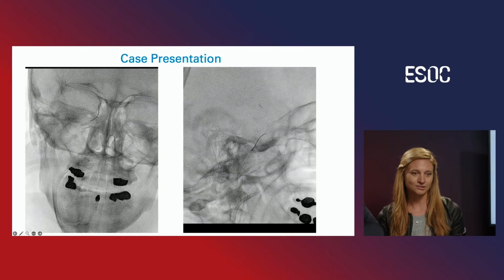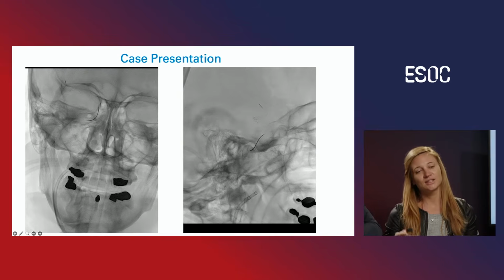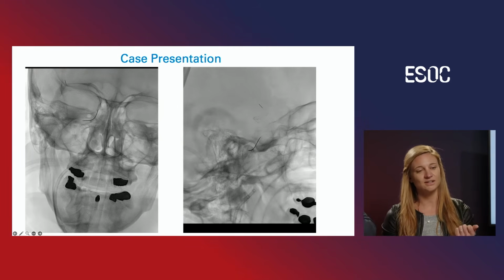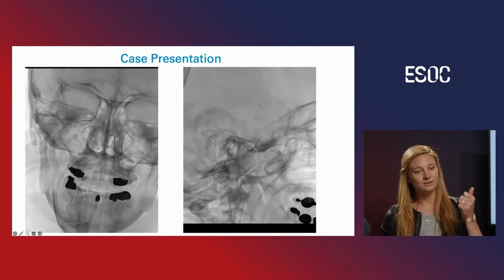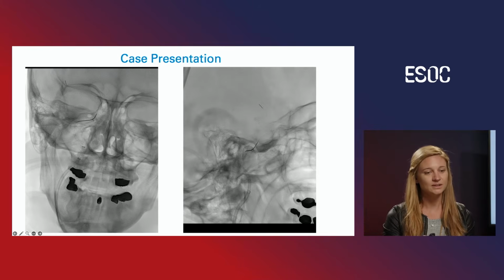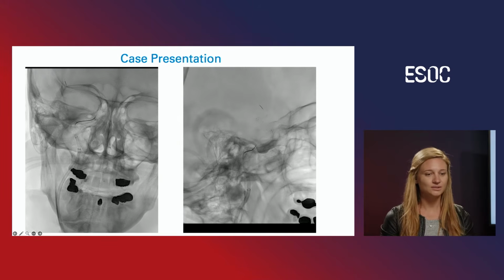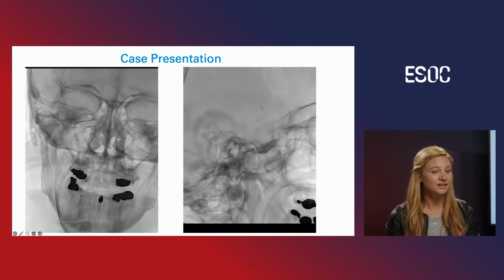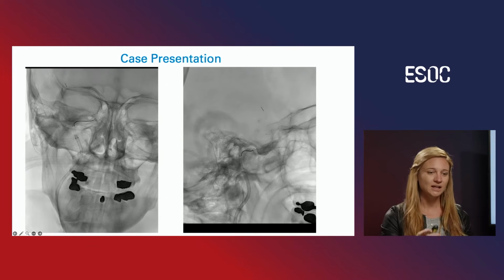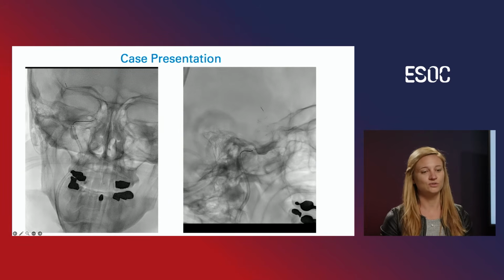So I can show you one trick you may know from the aspiration maneuvers. You bring the stent retriever through the thrombus, expand the stent retriever, and then use the stent retriever as an anchor. You pull on the wire of the stent retriever, and then you can straighten the vessel, as you can see here in the video. And then you can bring up your balloon guiding catheter to the point of the skull base. You see here it walks up very easily when the vessel is straightened, and then, reaching that point, it's a correct place to open the balloon for the maneuver.